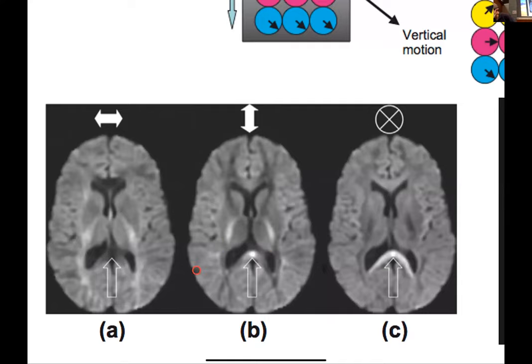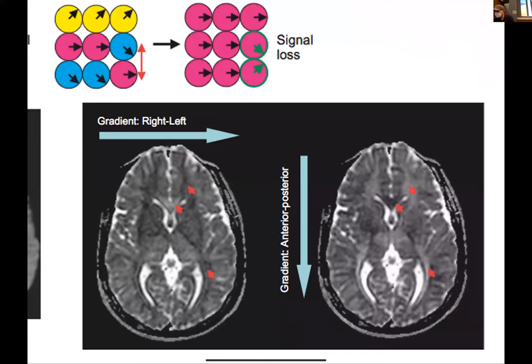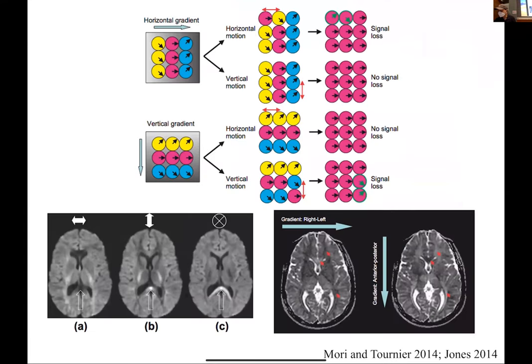They seem darker. Yeah, that just means that in the brain, you have big bundles and you have lots of little fibers. And so that means that there's probably some small fibers here that are going in that direction. And interestingly enough, it goes dark here when they go through plane. So now you would conclude that there's probably some fibers going through plane there. Yeah, so the diffusion gives you a lot of information about what's going on with the fibers, right? That's basically going to be the same thing. So I think that was a good example.